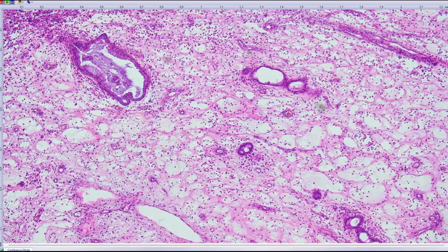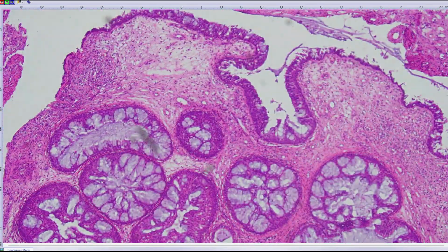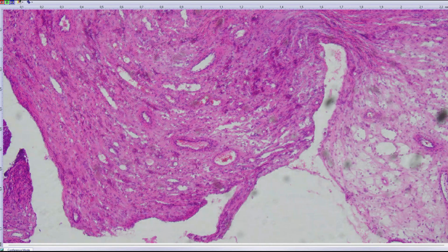But in addition, we see here areas that look like inverted papilloma, but inside the inverted papillomas you see this mucinous differentiation, and I would even say mucinous adenoma-like proliferation. I still don't have genetics of these lesions, but we have several cases of this as well. Just to show you that there are not only 3 types of nasal papillomas, there will be at least 10, maybe more of them.